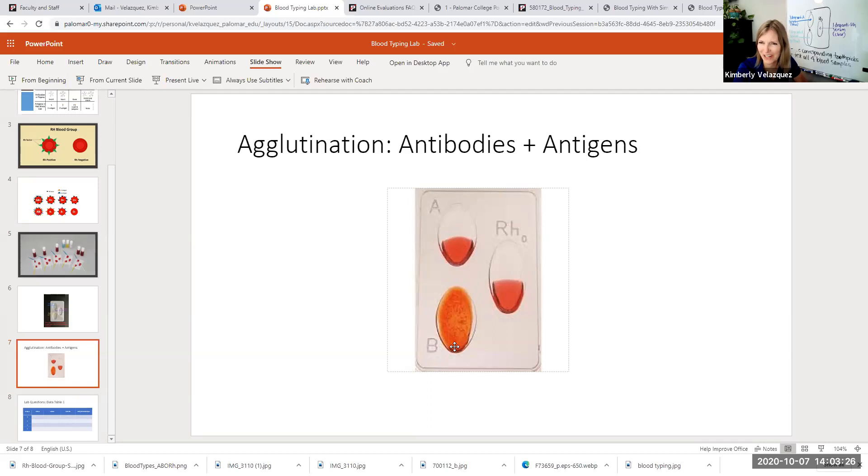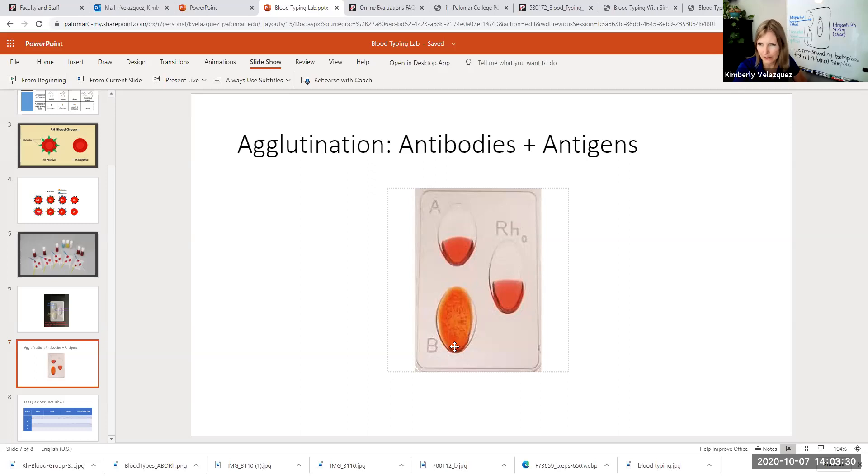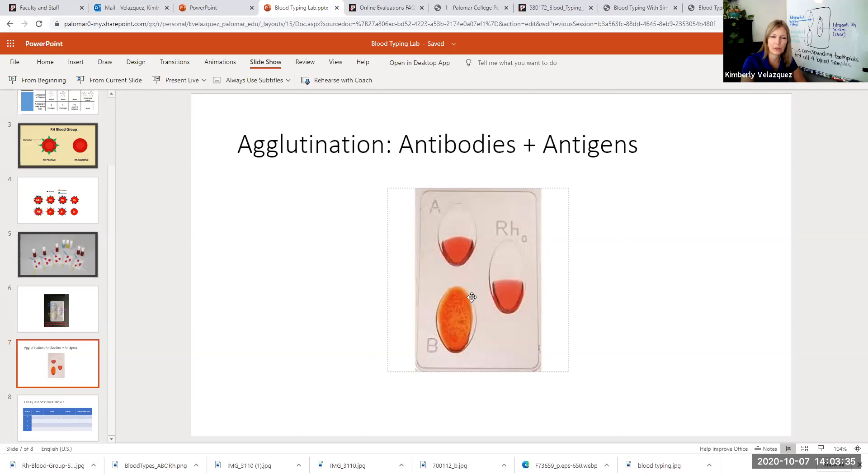That means that the anti-B serum reacted with and bound to a type B antigen.